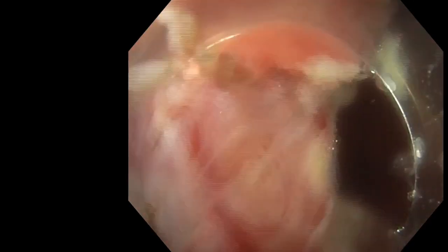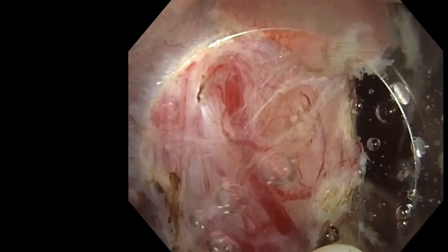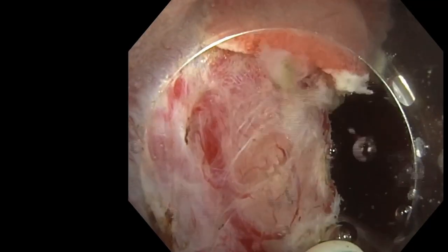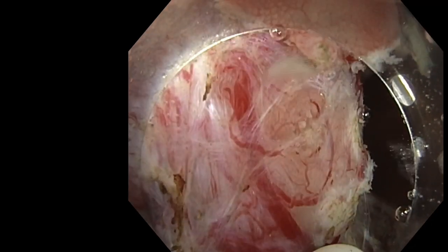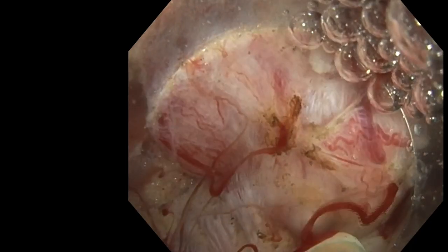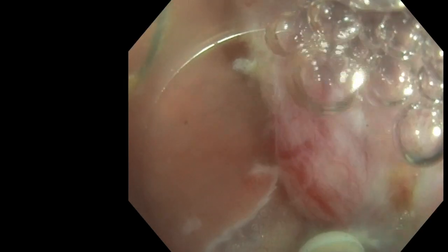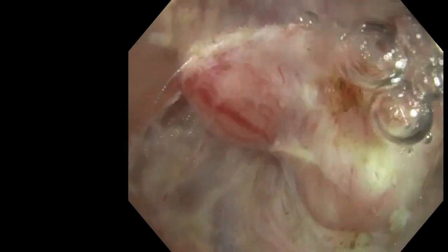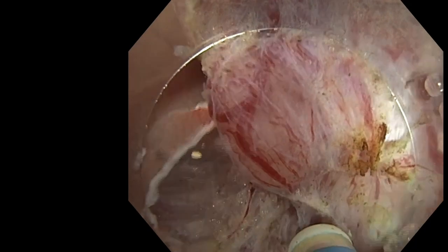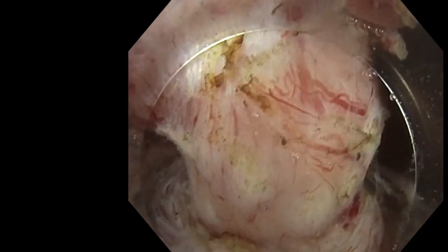It depends really of the gravity, the easiness of the case, but in difficult case like here, it's nice to have all the helps we can have with both traction, underwater, cap assistance to improve the visibility, RDI if needed in case of more important bleeding to see, because in this case, if there is a bleeding, it is sometimes dangerous to coagulate because you can damage the mucosa or the muscle.